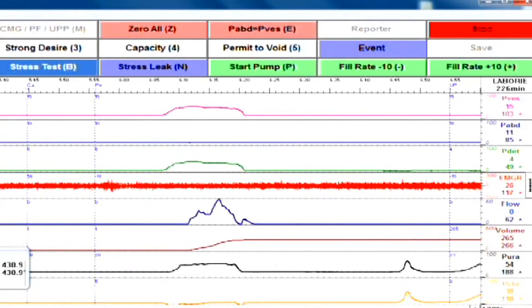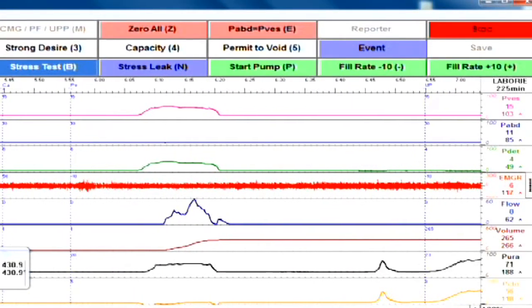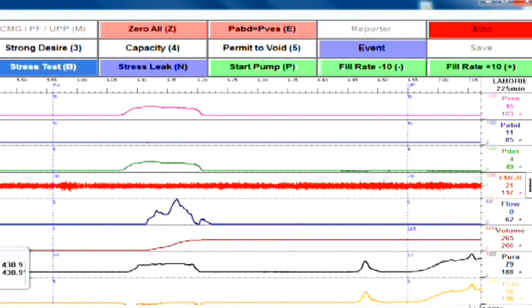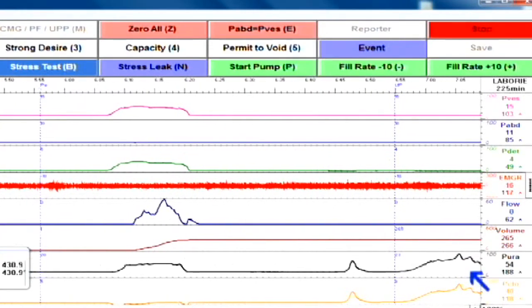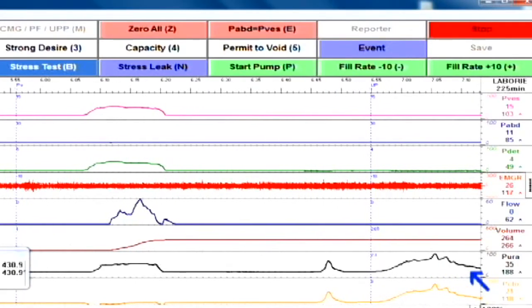You'll then start to pull the catheter out as slowly as possible. Note that you'll see the pressure in the P-URA channel slowly rise. When pulling slowly, it should look like a bell-shaped curve, like this one.